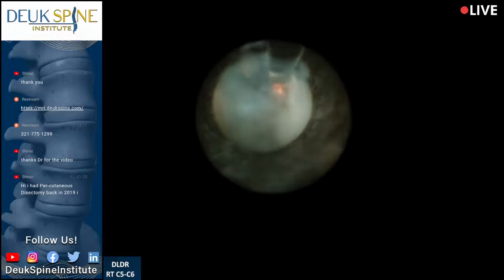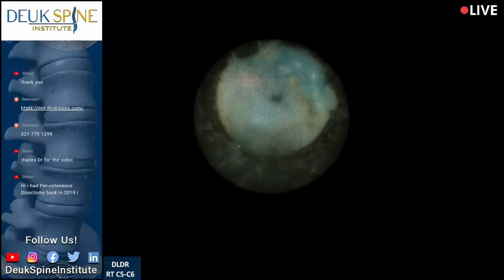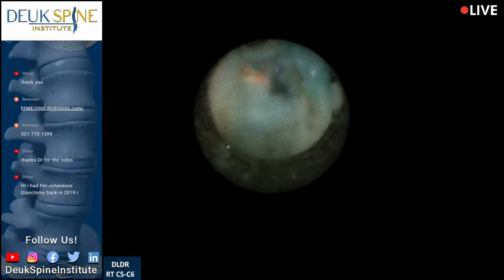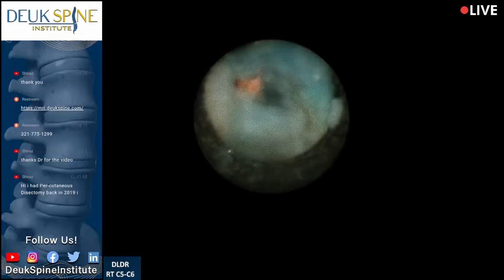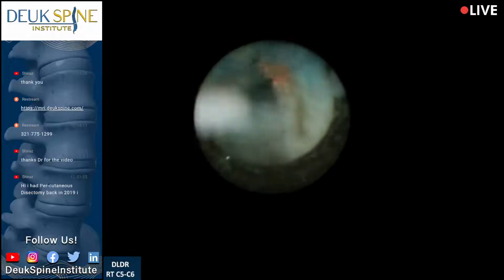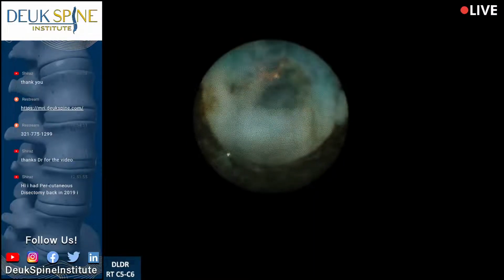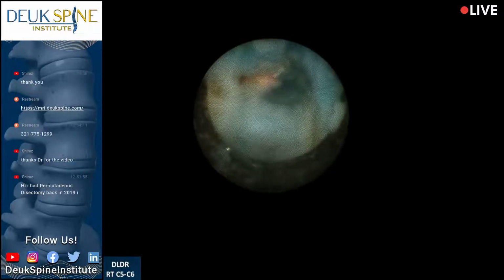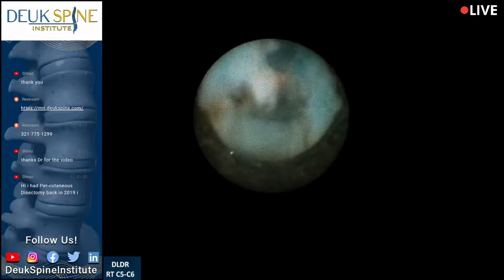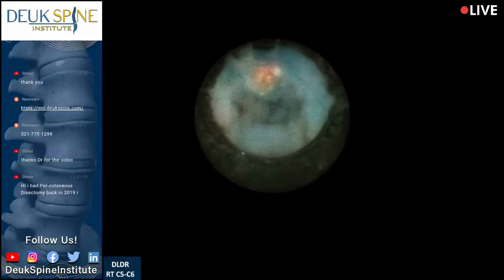So whatever trauma this person had to their neck smashed the disc so hard and then pushed it out through the tear. And a lot of times the disc fragmentation into little pieces occurs at the same time that the tear occurs. You see the foramen where these pieces were coming out? It's now kind of empty down there. Still have a few more pieces to get out.